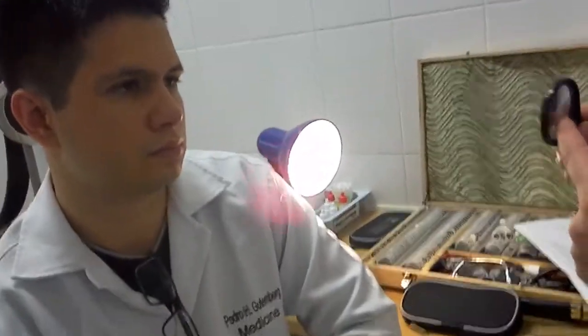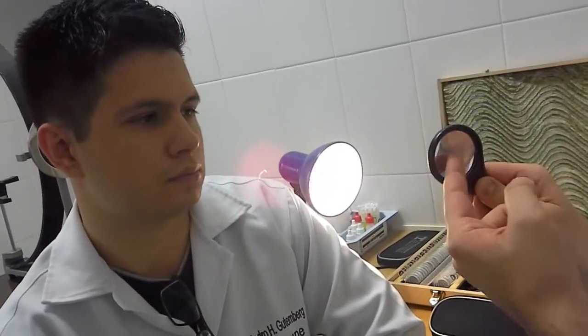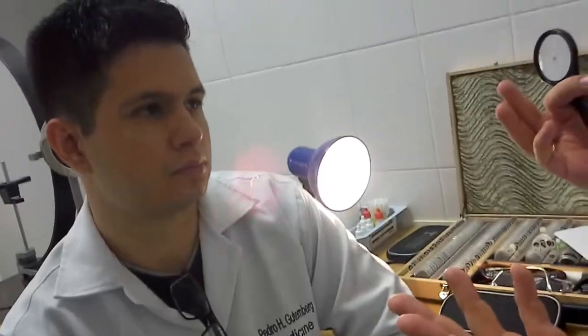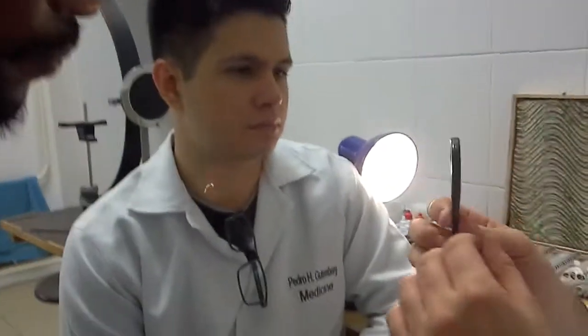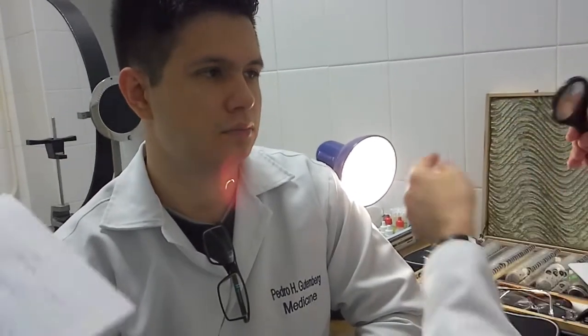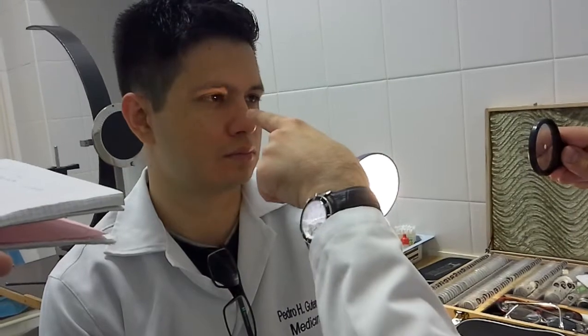The position of the lamp is opposite the doctor. You look through the aperture in the center. Only the person examining can see the fundus — only the one who looks through the aperture. It is like a diaphragm in a photo camera; the principles are the same. Our eye is like an optical instrument, and our pupil is like a diaphragm. It is just simple physics. It is better to use a concave mirror, because it is necessary to put the focus of light rays in the patient's pupil and then toward the retina. In the case of a plane mirror, the focus is very blurred, but a concave mirror converges the rays, and the intensity of light increases.